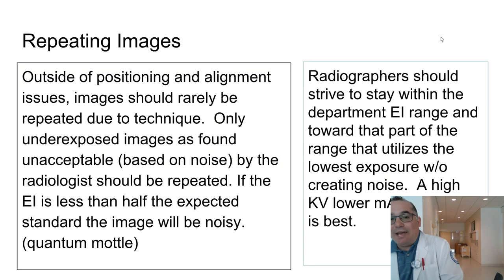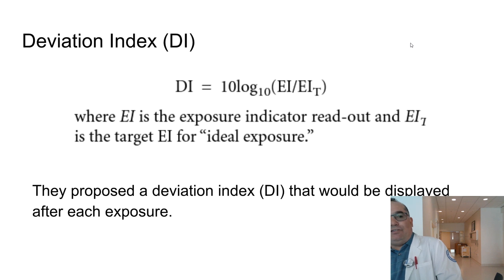So what if we could standardize this? What if we could create, you know, a standard? I'll come to repeating images in a second. What if you could create a term that goes across all of the manufacturers so that on your many, many part-time positions and jobs, it's just one number to memorize, or one group of numbers at least. That would make life easier. That's a standard, right? Standards are very useful because everyone, you know, plays in the same sandbox.